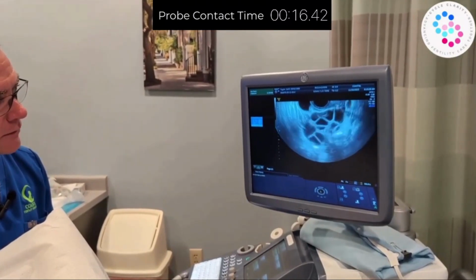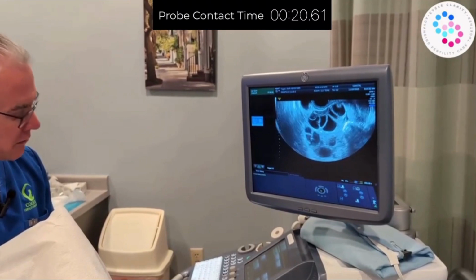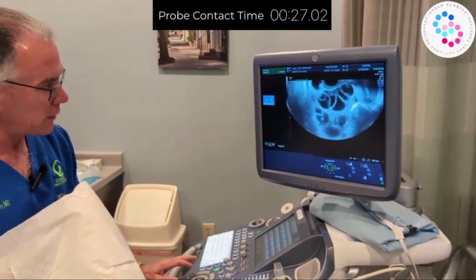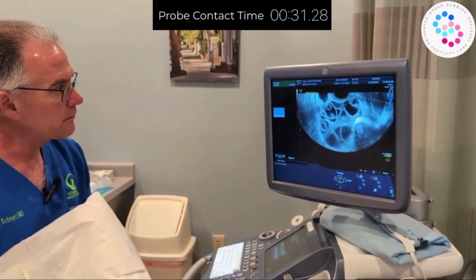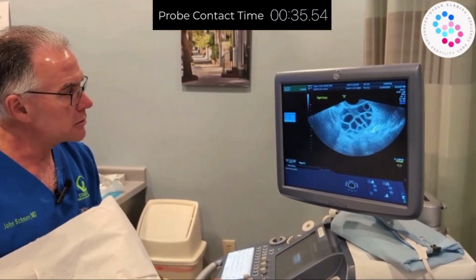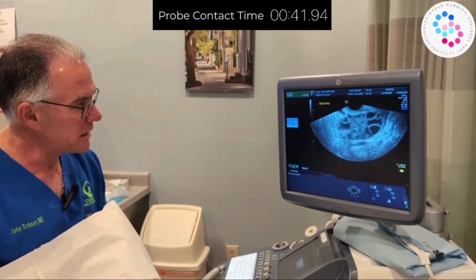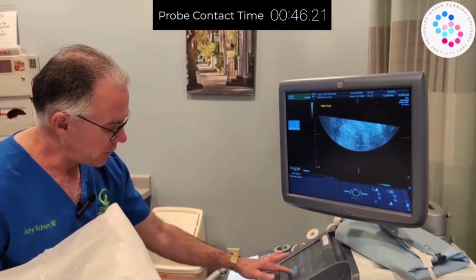They're almost touching. And so what we're going to do is just take a look at each ovary and take some measurements. We're going to do this with three-dimensional ultrasound. First thing we're going to do is label that ovary as right ovary. Then we're going to set up our 3D window, and go ahead and acquire the image. So we now have imaged your right ovary. Then we're going to hit a special sequence of buttons to send this off directly to the Microsoft Cloud for analysis.